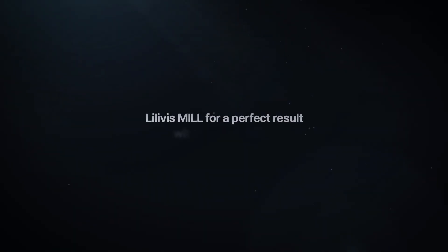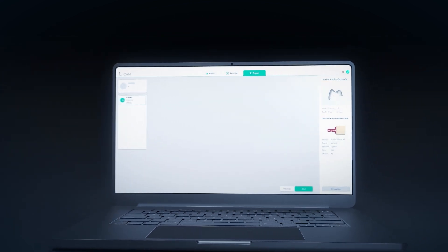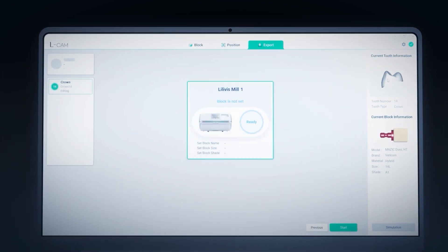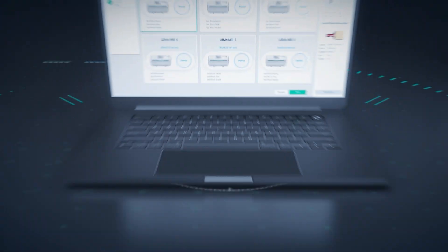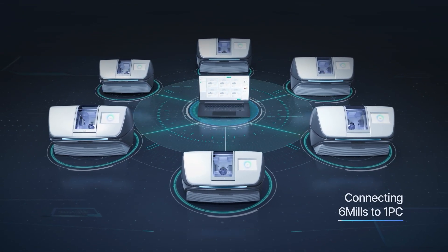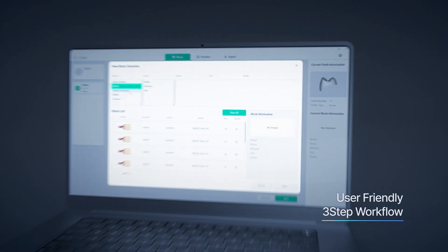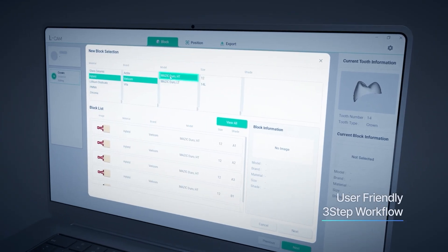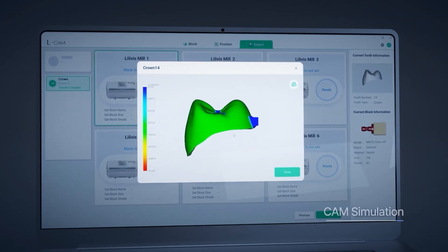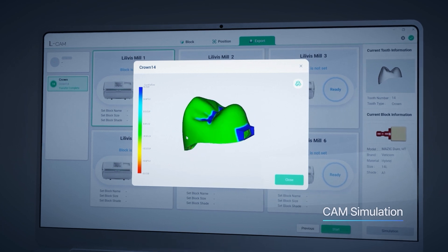The Levis Mill — for a perfect result with just one setup. The LCAM software makes the milling process simple and efficient, allowing up to six machines to be controlled and monitored from a single PC, maximizing efficiency. The simple three-step process enables anyone to quickly and easily produce prosthetics, and the CAM simulation feature allows for accuracy checks in advance, enhancing the quality of the final product.